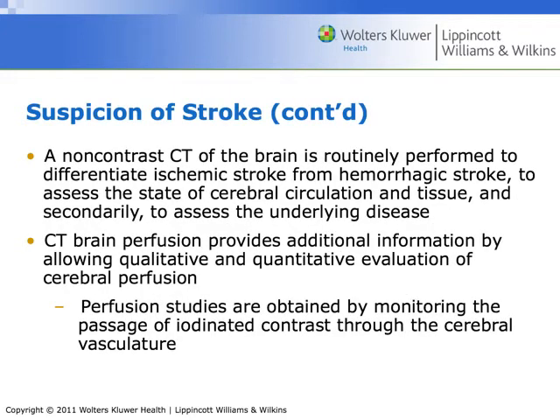So, nevertheless, time is of the essence. Any place that is regularly treating stroke patients is going to have a stroke protocol in place, and this is why we get paid the big bucks in CT. The minute that they call this code, or they believe that the patient may be having some kind of stroke, they need to get that CT scan. Stroke protocols require that they get the CT scan completed and read in 30 minutes. So knock people out of the way, get to that patient ASAP. They understand. Don't be polite. You've got to get information stat so that they can start a drug therapy if needed.